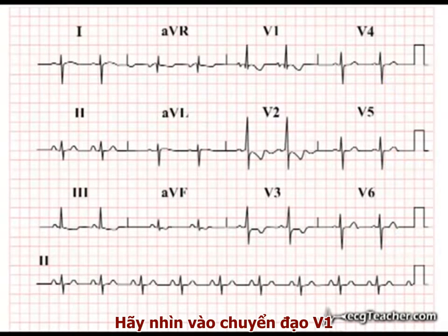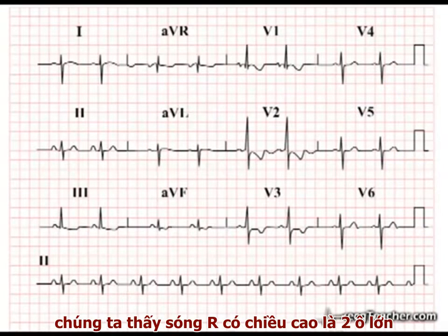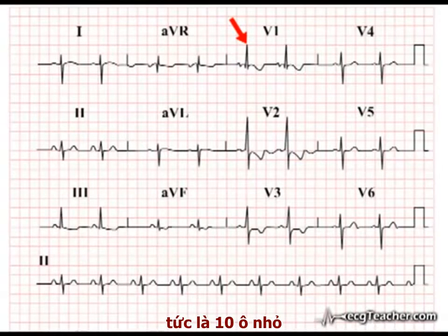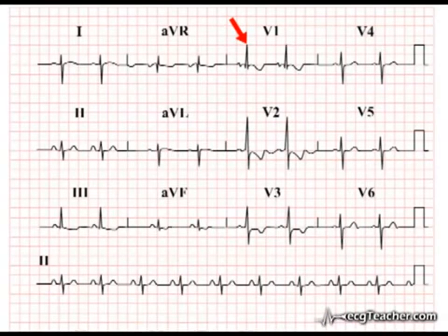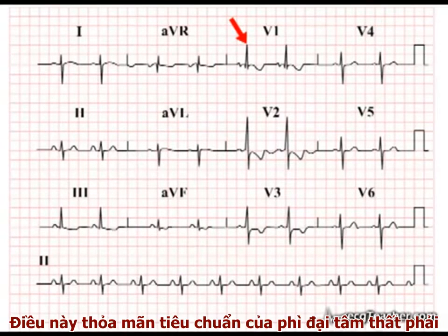When we examine lead V1, we find that the R wave is two large squares in amplitude, or ten small squares, well above our limit of seven small squares. This is consistent with underlying RVH.